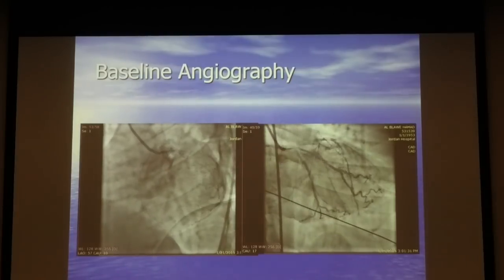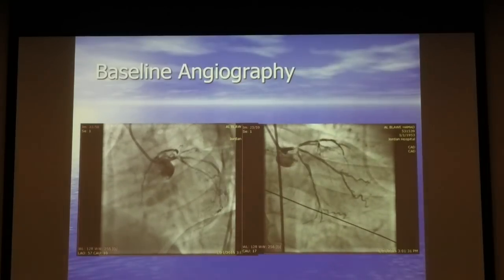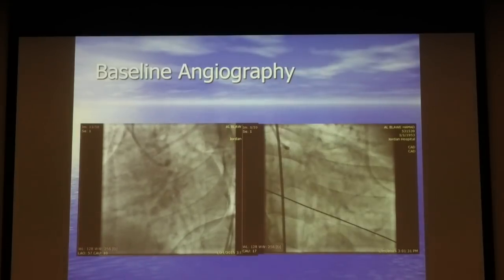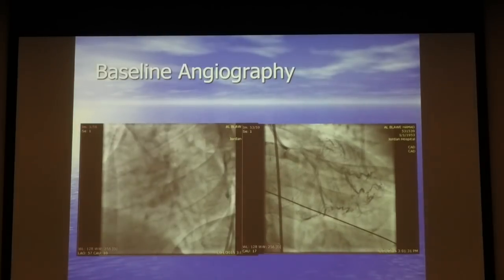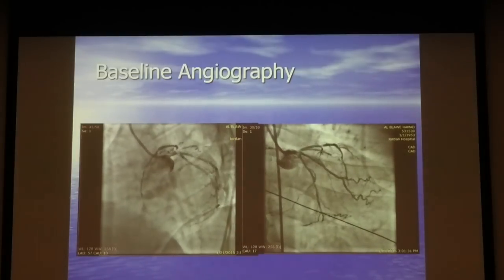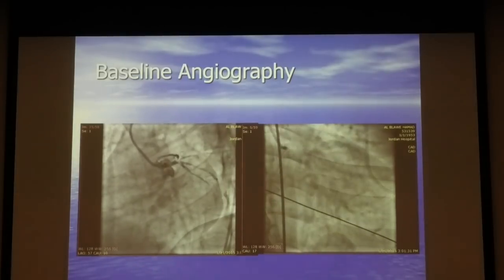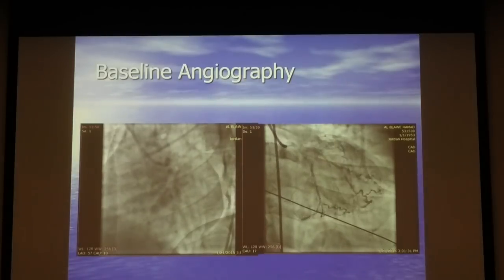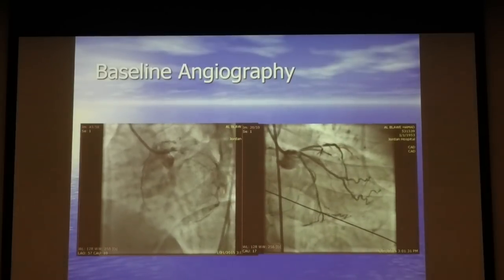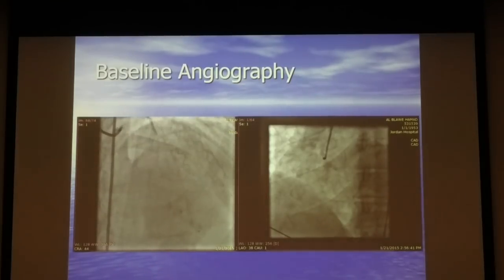Should I come? After offering him surgery, and after he refuses. Should I say no? Okay. Some details on this patient: he had a stroke and absolutely refused surgery. His ejection fraction 35%. He was completely unstable. Acute coronary syndrome, dynamic ECG changes. So we offered him surgery, but apparently he refused. So this is what we did. These are more views. And what makes it worse is that the right coronary artery is not a huge artery, it's a kind of codominant.